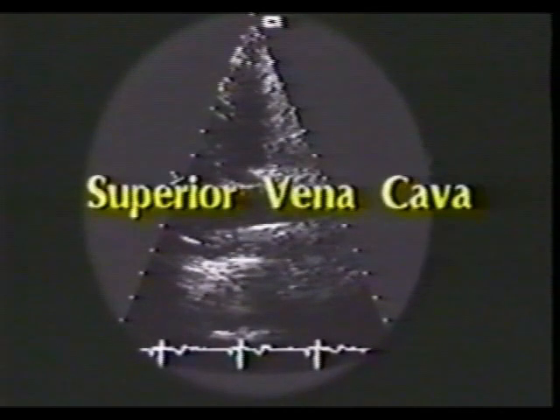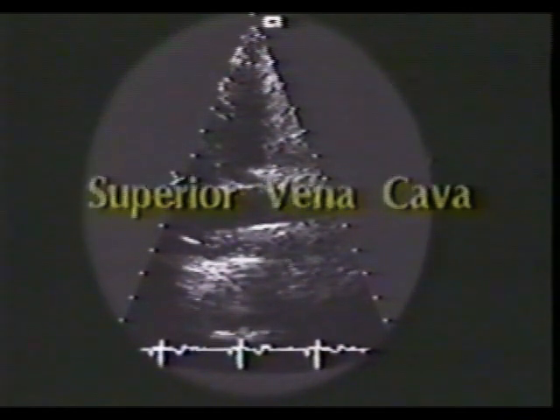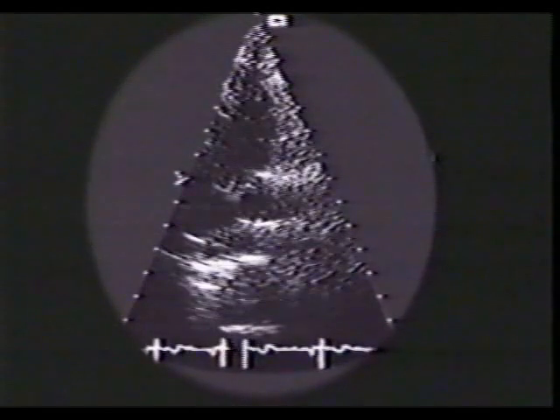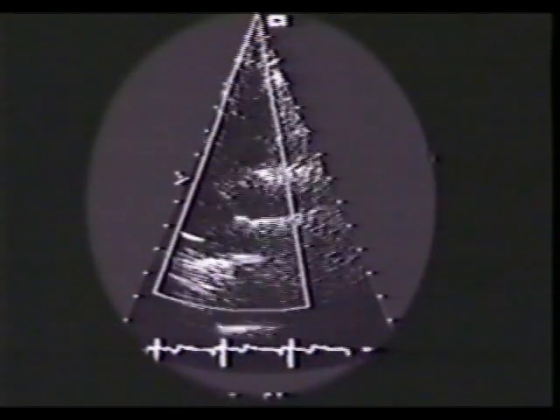Utilizing the suprasternal and supraclavicular positions, we can define the position of the superior vena cava and also can determine if left superior vena cava is present. This is the right supraclavicular view of superior vena cava. Here is right pulmonary artery. In real time, you can note the position and the normal flow pattern in this superior vena cava.